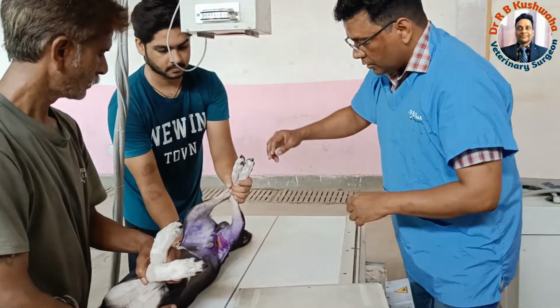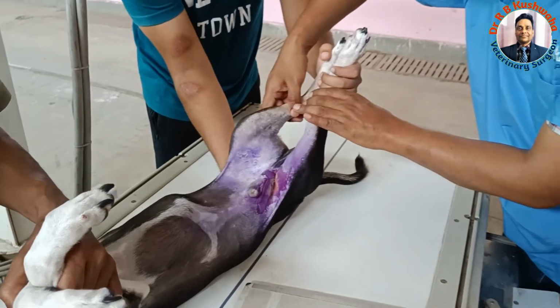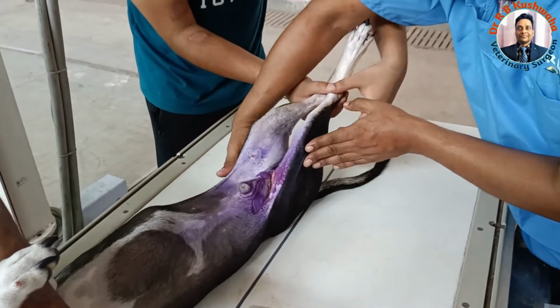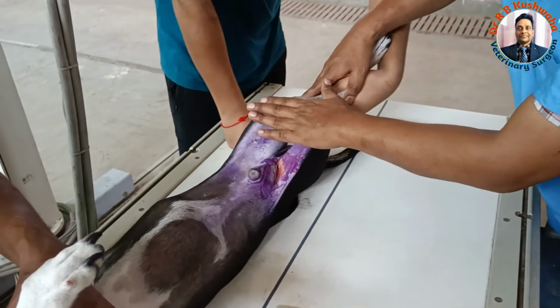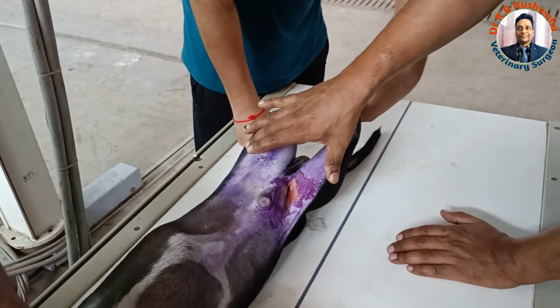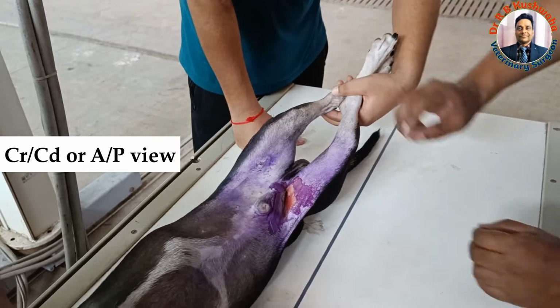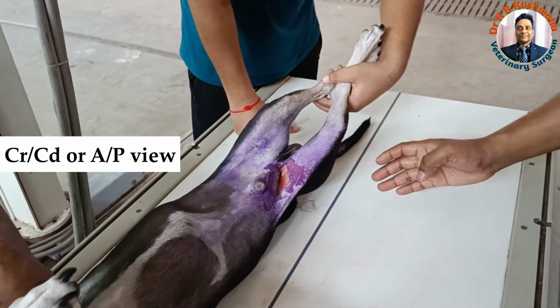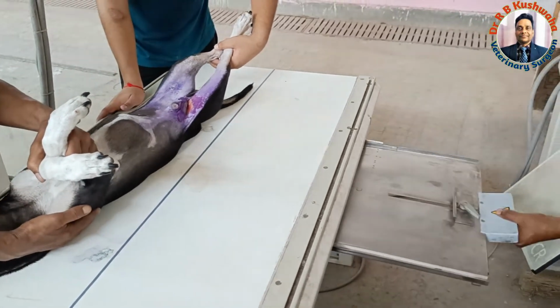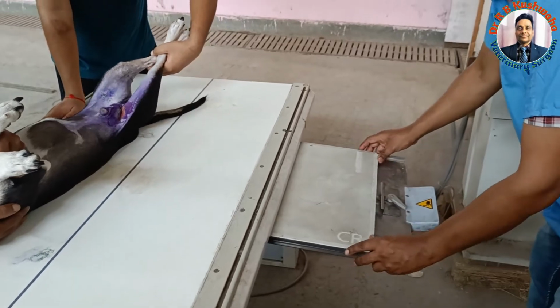Now we are going to take the AP view. For the AP view of the femur, we normally position the animal in ventrodorsal. Although the animal is ventrodorsal, as far as the femur bone is concerned, it is basically the AP view, because this is the anterior and this is the posterior part. Now the thickness has changed. In this particular case, you could see here.